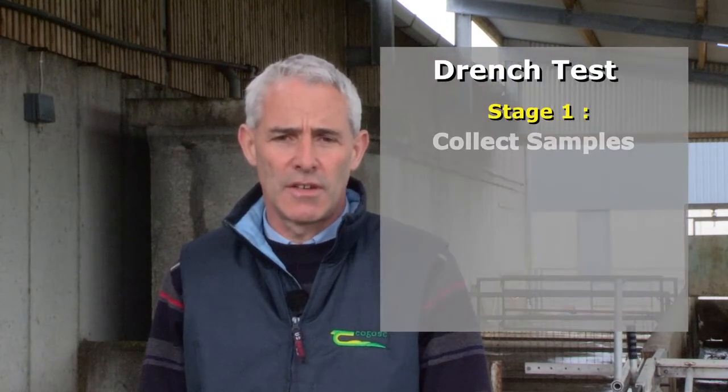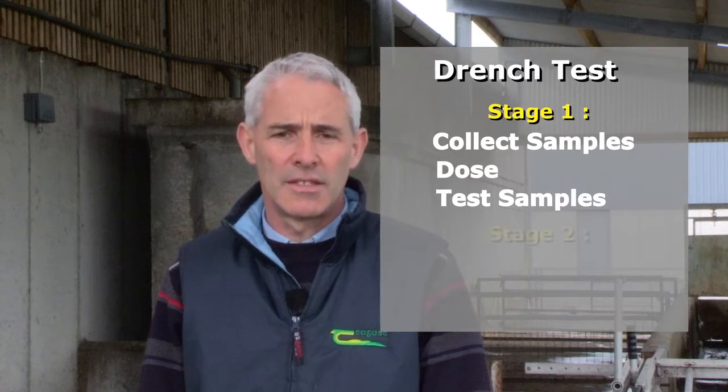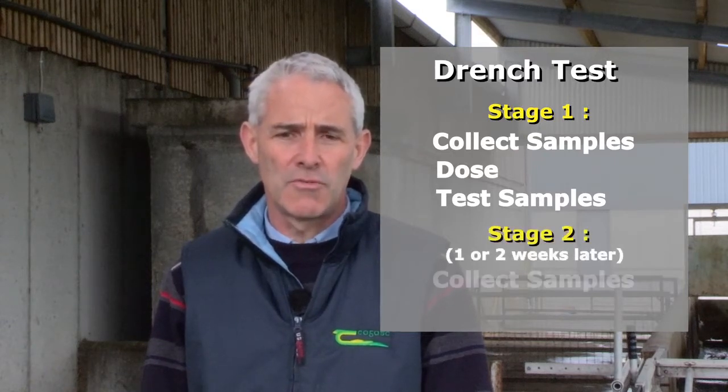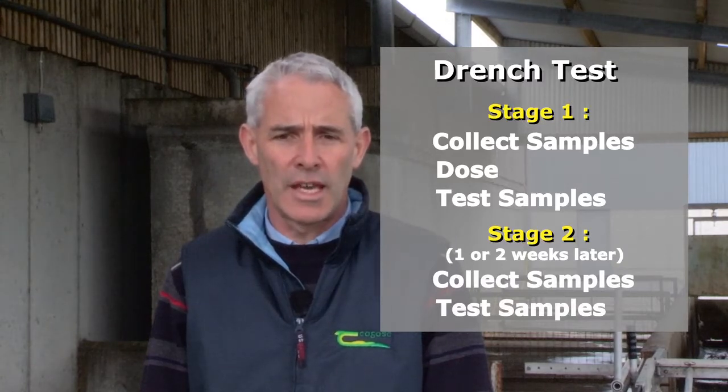Fecal egg counts are used to establish the level of anthelmintic resistance to parasites in sheep. A drench test involves 2 stages. In the initial stage, fecal egg counts are taken on the same day that lambs are dosed, and the second stage involves retesting the lambs 1 to 2 weeks later to check if the dose actually worked.